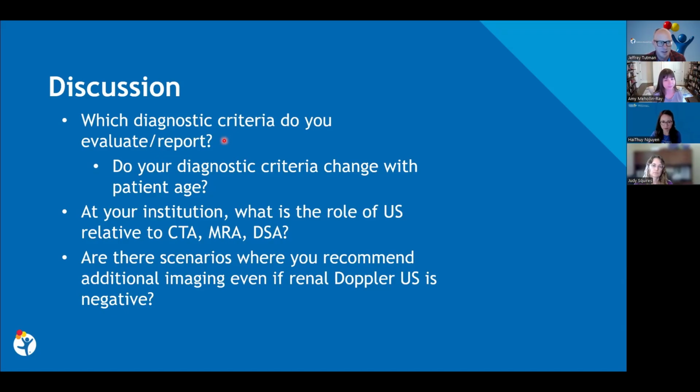Yeah, we kind of settled on that just based on the literature. Like I said, on the adult side, there's a much more robust evaluation of those ratios. And in the pediatric patient population, it's exactly what you're saying, their age-based variation. It seems to make more sense to use the ratios to have some control for their hemodynamics. But I wish some of those papers had looked at those ratios and not just the broader criteria that I mentioned, the absolute velocity and the RIs alone.